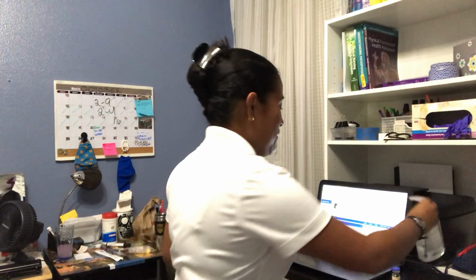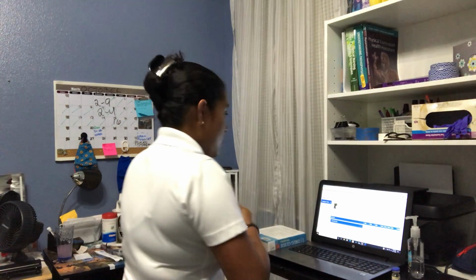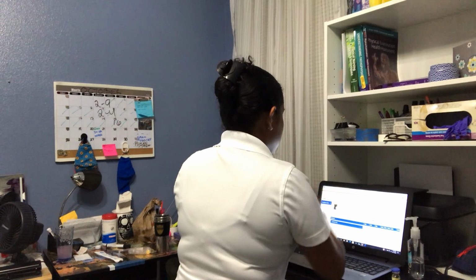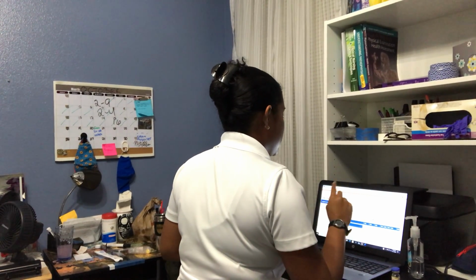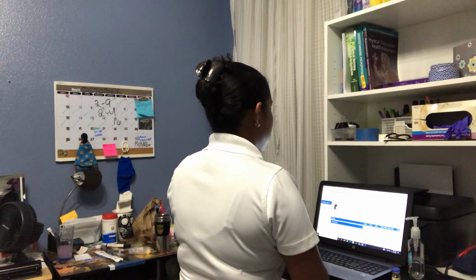I'm cleaning my hands before I go onto the computer and see what medication he's scheduled for today. Alright, I see that I have Oscar Simpson, my patient. I see his date of birth is XXXXXXX, and I see he's allergic to pollen and codeine.